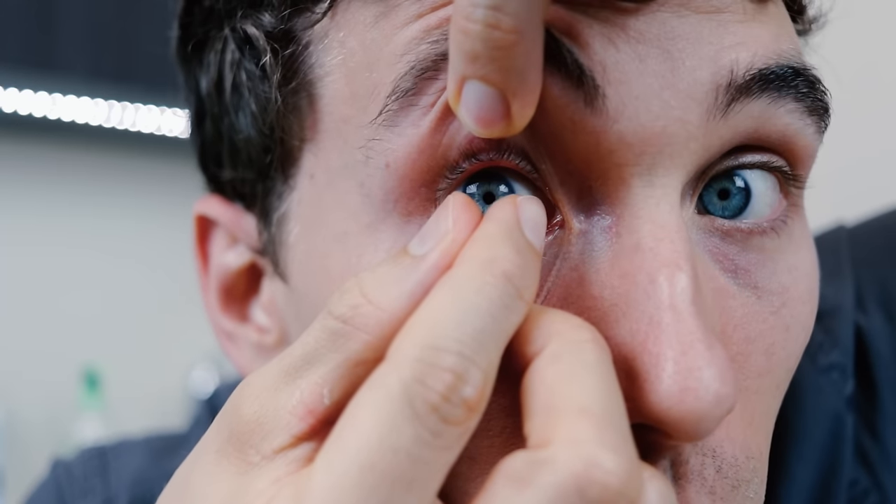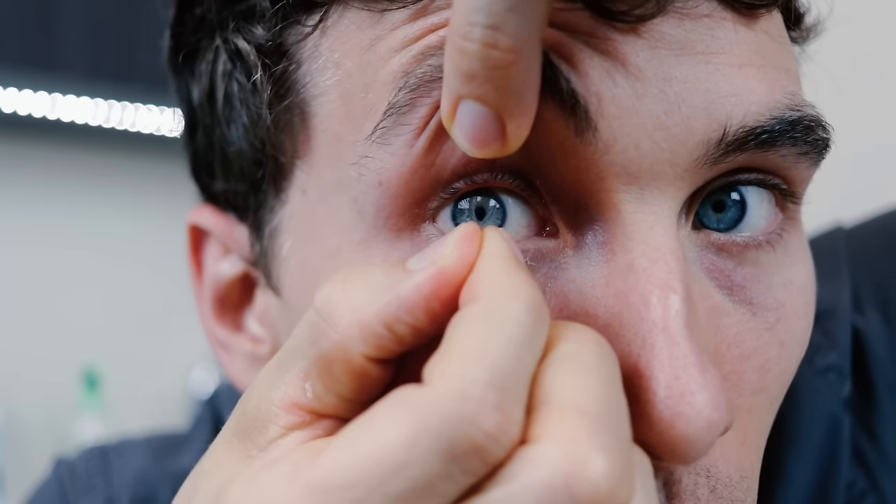Let me show you this method one more time and then I'm going to show you another method of how to remove these contacts. I'm going to hold my upper eyelid, then I'm going to hold the lower eyelid, use my little kissing fingers, touching the lower one-third, gripping and removing.